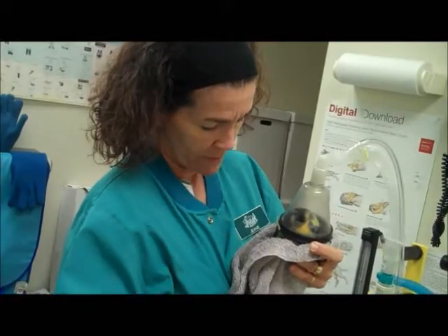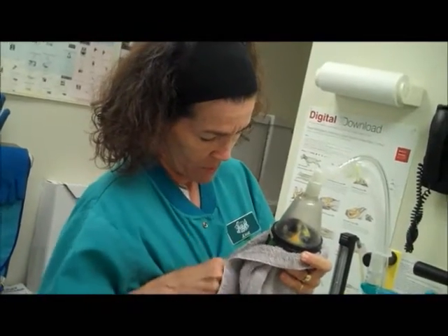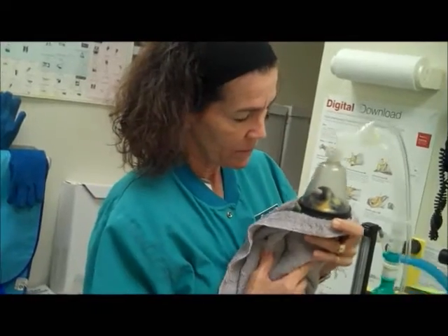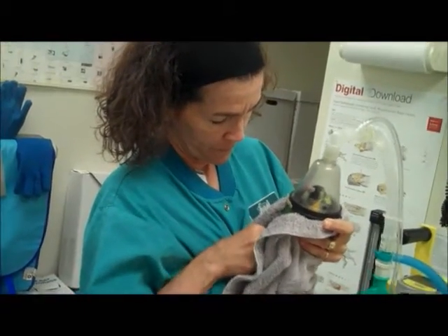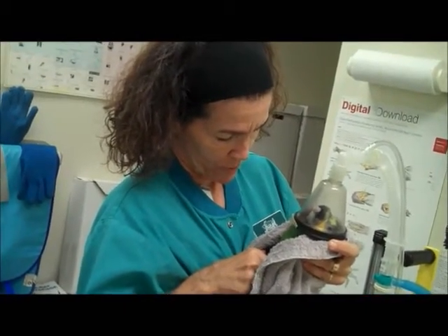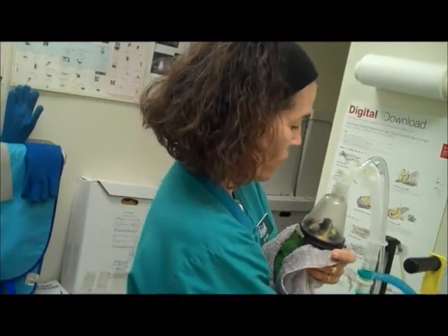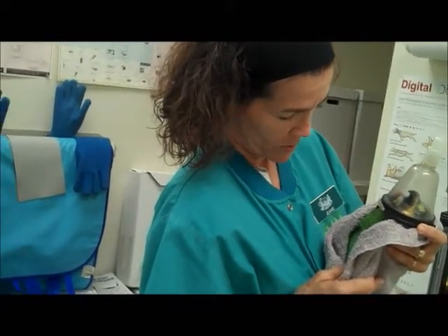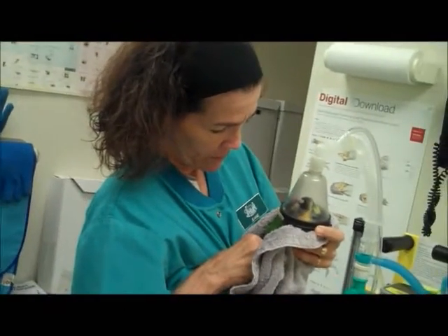I have a stethoscope on the table. It's doing good — he's getting sleepy. Watching, breathing. I'm going to lower it a bit. Watching, feeling.